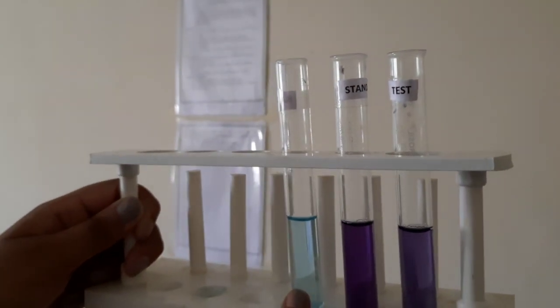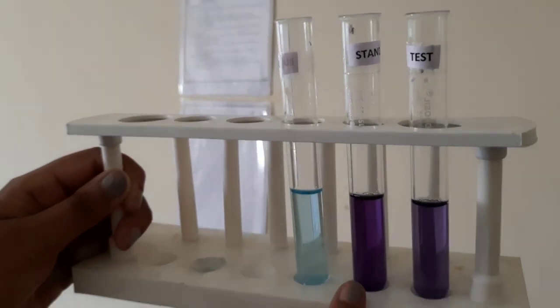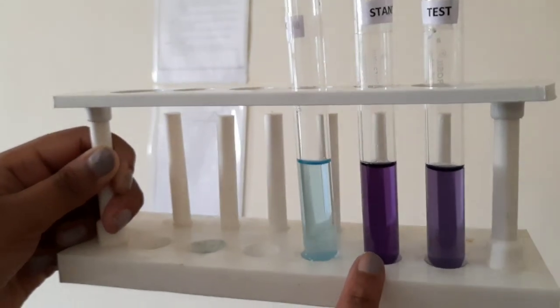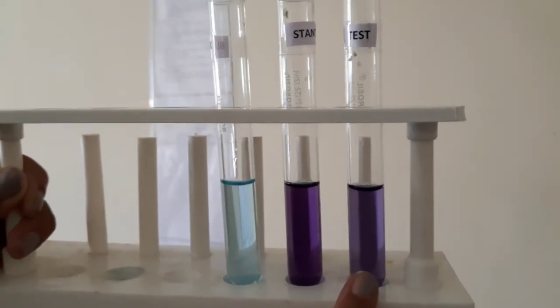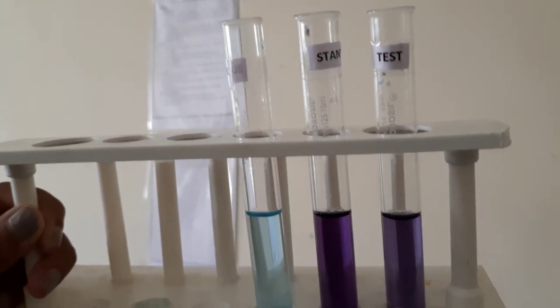The blank tube is still blue because there is no protein present in it. The standard tube, because it is 1% protein, the color is very dark. It has already formed purple color and it is very dark. And you can see the test sample, the urine sample, also had some amount of protein. Therefore, it has also given us purple color.